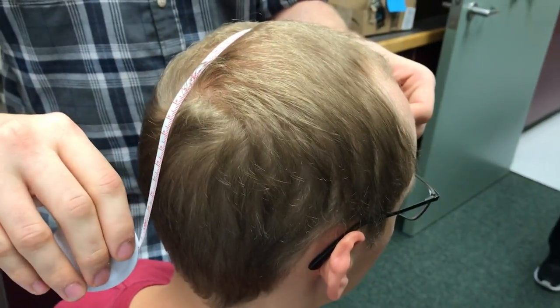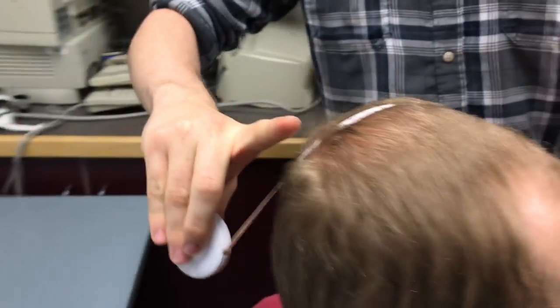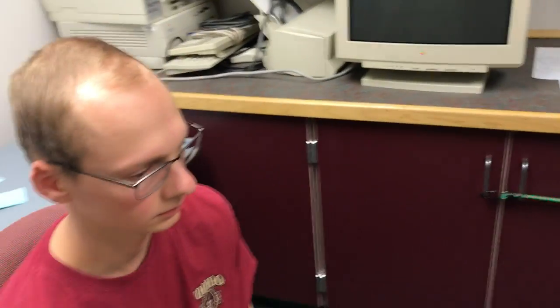You want to start around the forehead — it doesn't really matter as much where you go, you're just looking for the midpoint. That's probably the right fit for that.